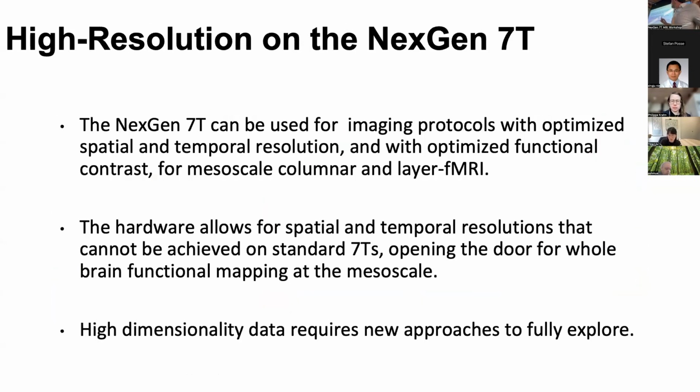So the NexGen 7T can be used for imaging protocols with a very high spatial and temporal resolution to really push what we can do with fMRI. And it's something we're very excited to dig into, especially with our collaborators through the U24.